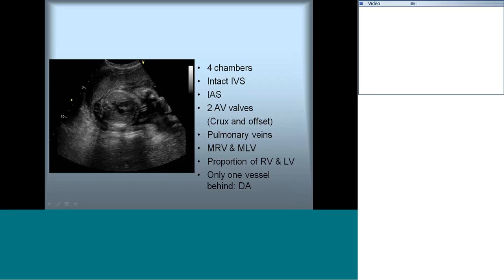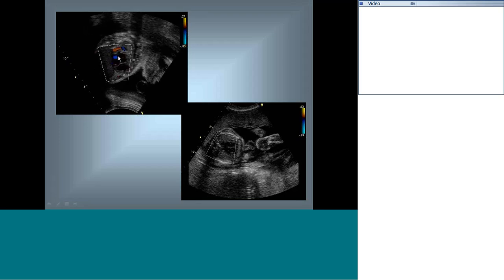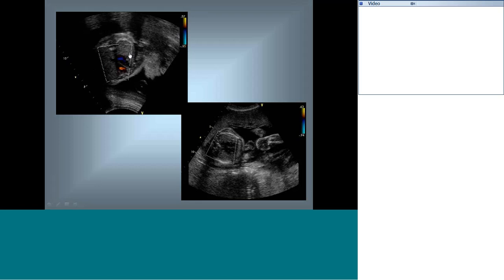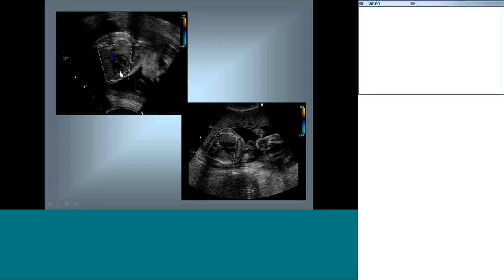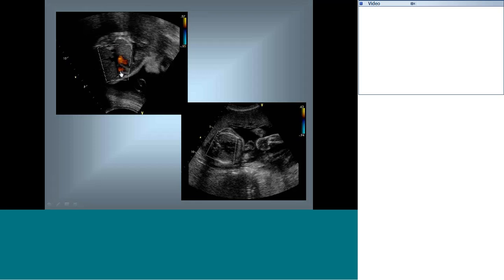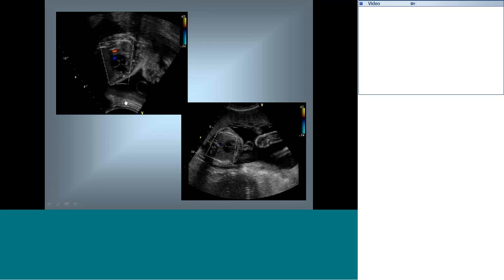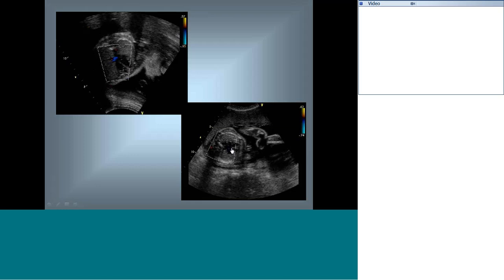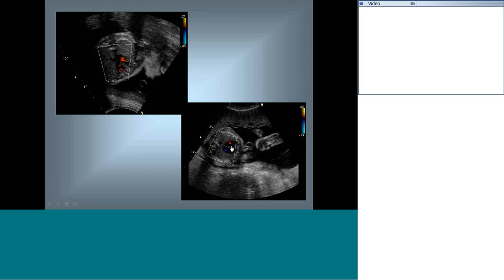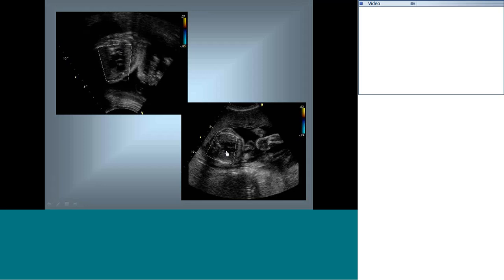In the four-chamber view with color, make sure you can see at least two pulmonary veins entering the left atrium and the AV valves are completely patent with no regurgitation — particularly tricuspid regurgitation, which is important to check in early gestation. Also confirm the patent foramen ovale is unrestricted, with flow from right to left and the flap moving into the left atrium.